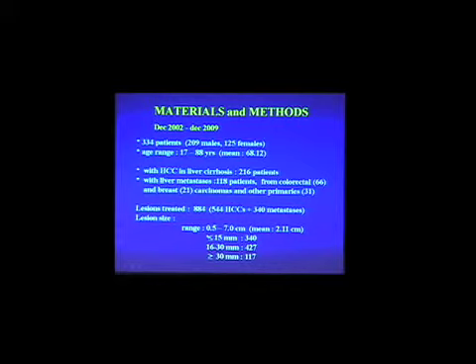Just a few numbers. In this period, 7 years, more than 300 patients treated using this system, mostly liver. Lesions treated are 884. You see here the size range. And you see that 340 were smaller than 15 millimeters.